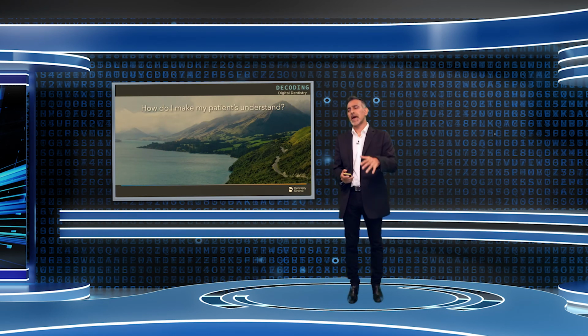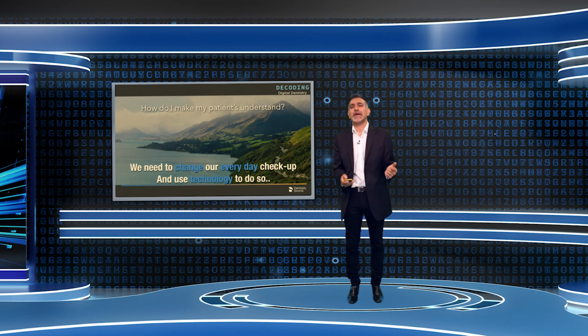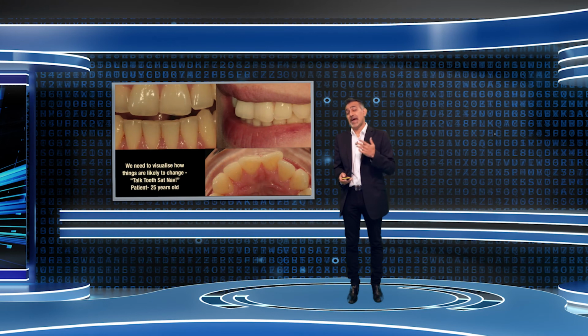So how do I make my patients understand that this is actually an important thing to do rather than perhaps just a cosmetic thing? What we really need to do is, as dentists, change our checkup and start to look at some other things that perhaps we don't do traditionally. And I'd suggest we need to be using technology to do so. As mentioned, I've been using cameras for years and taking photographs of patients that I haven't treated just as much as the ones that I have. As mentioned, with scanners, we can do the same thing.